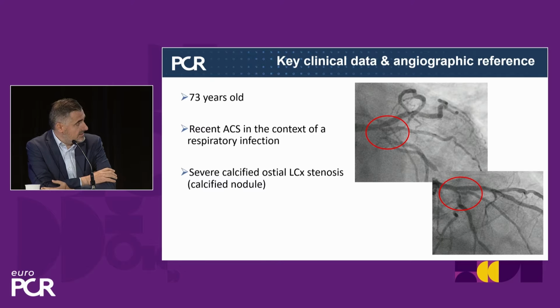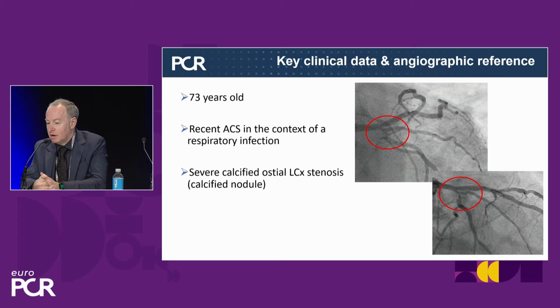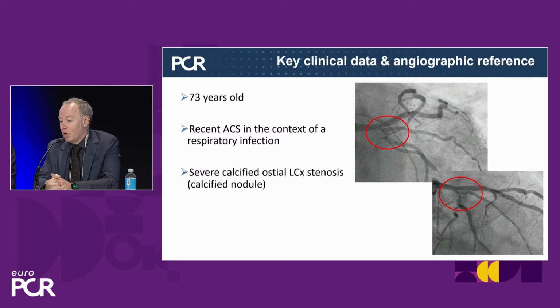Hold on, let me pitch also Peter's opinion. What is your guess about this lesion, Peter? Thank you very much. I agree. I echo those thoughts. It's a very complex case. Calcium, tortuosity, and quite an angle from the left main stem. For me, imaging is a key component of this procedural case. And the imaging that I would probably want to use, because I'd like to have more definition from the calcium perspective, is OCT. But there may be some challenges in delivering the catheter.